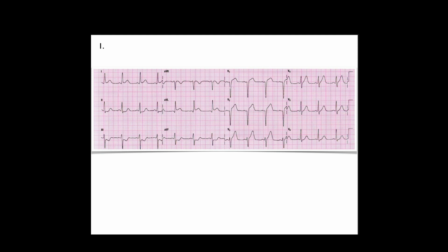So the question, that was great. The question you want to answer is the reason for the ST depression. I think in this case, the reason is reciprocal changes with lateral.